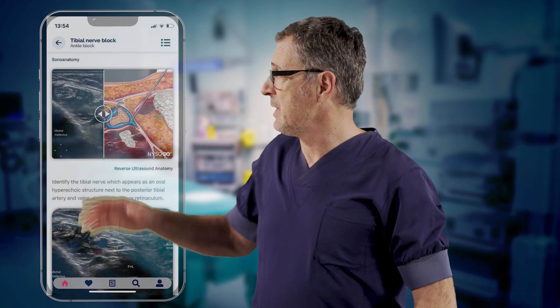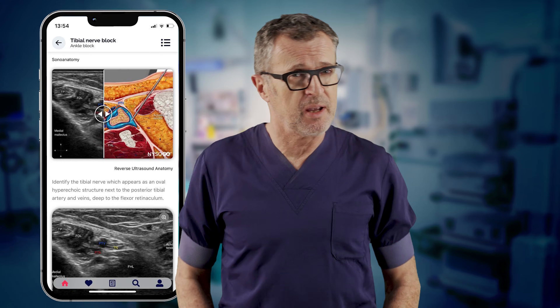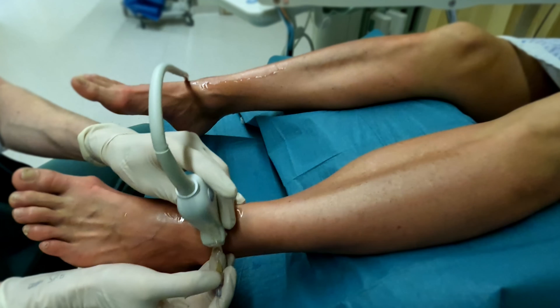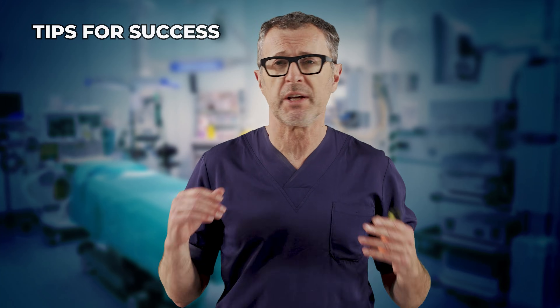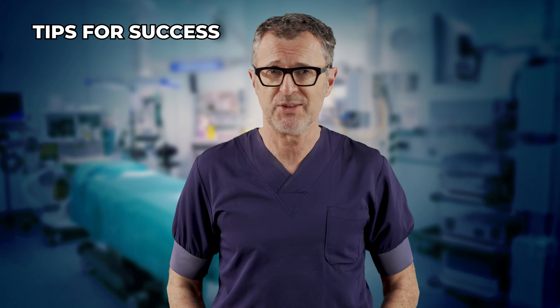In this video I will explain what you must know to be successful with ankle block for bunionectomy. In contrast to common practice, you don't need a full ankle block. There are some specific tips you can use to make it a success.